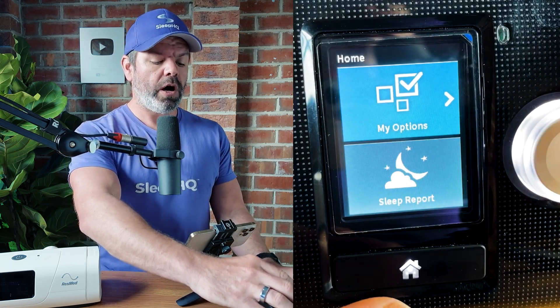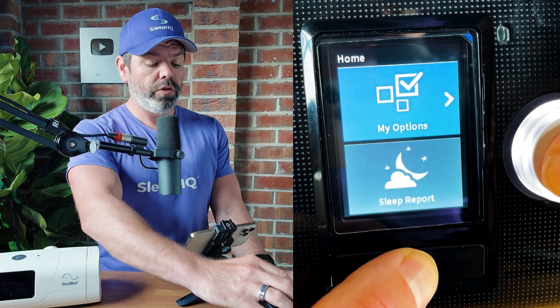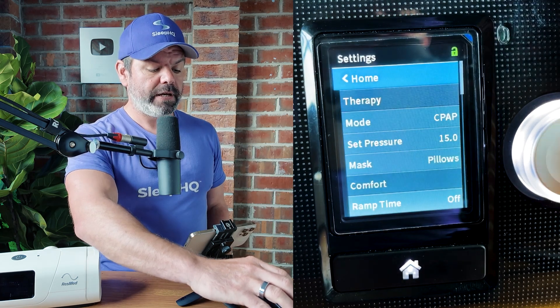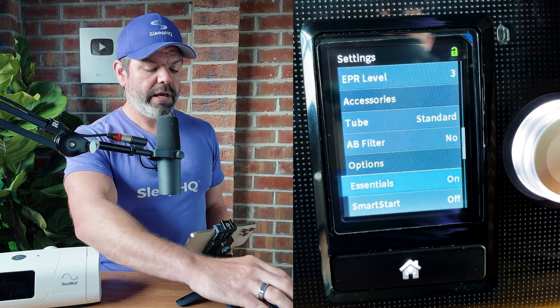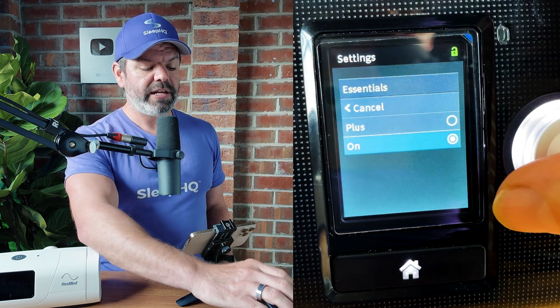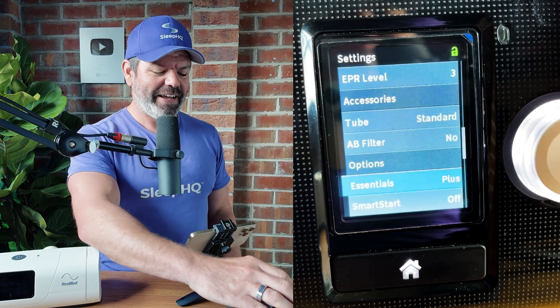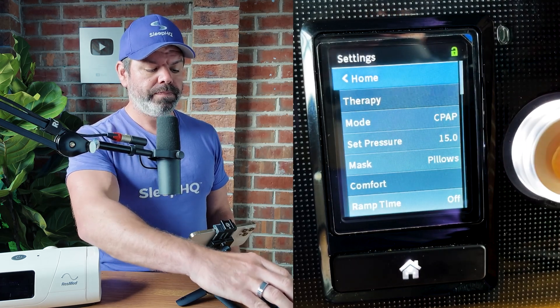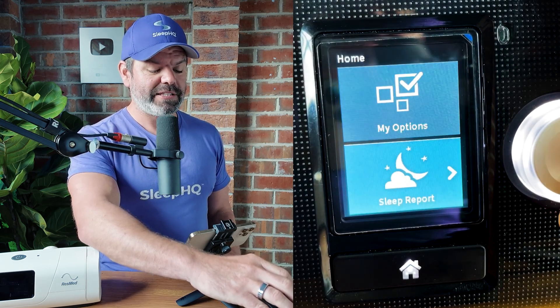To do this, go to My Options, then click and hold down the click wheel plus the home button at the bottom simultaneously. Hold them down — that enables the clinician menu. Then click Settings, rotate the dial down to Essentials. You can see it says 'Essentials On'. Click the click wheel and change that to Plus. Then rotate the dial back up to Home and exit the clinical menu.